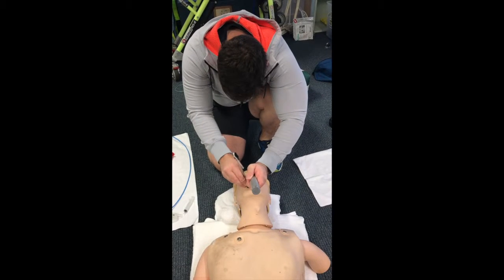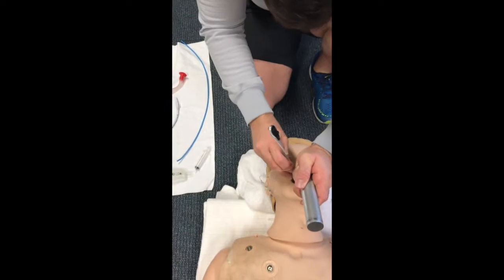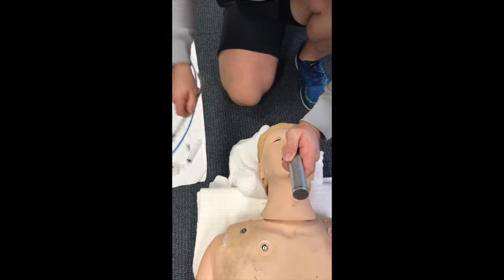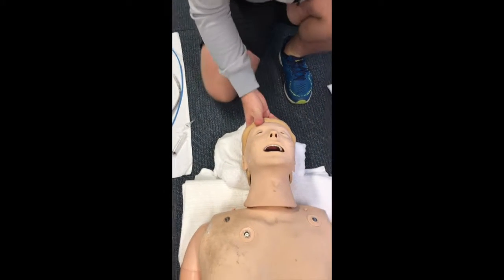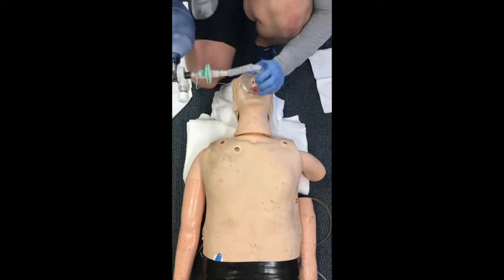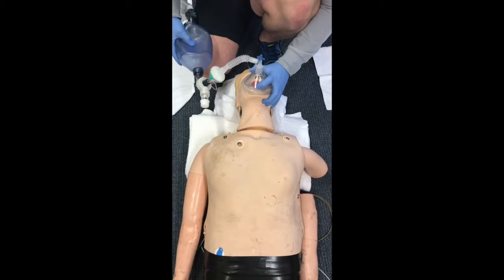And for whatever reason, I can't pass the tube. I can't get it in. And at this point, I need to realise I cannot intubate that patient. After not being able to intubate, I resort back to a Guedel airway and bag valve mask ventilation.